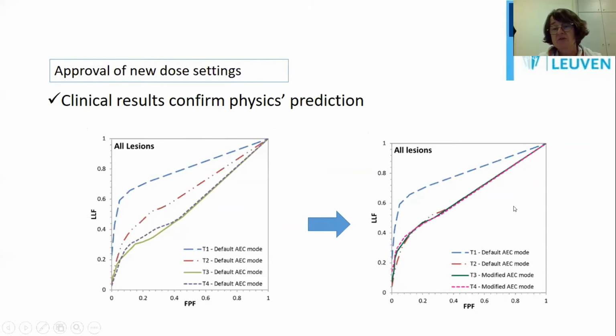Well, here is the result after the adjustment of the dose level, where still the thinner breast had a better result, but that was because physically the SDNR being identical for all the breasts was not completely true. We did not change the first group, which actually had a higher SDNR, but all the other groups came to the same lesion detectability, which was, I think, an amazing result.